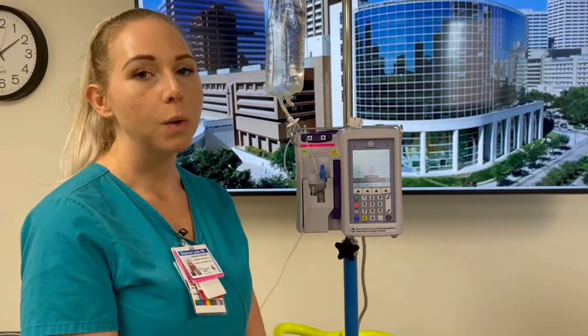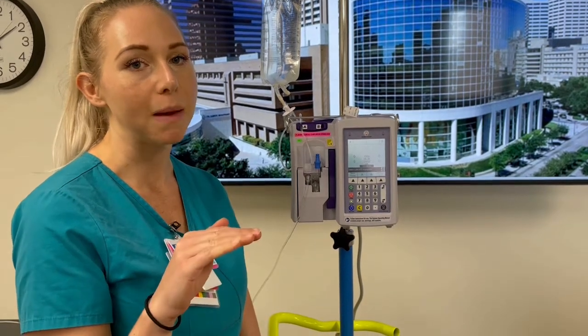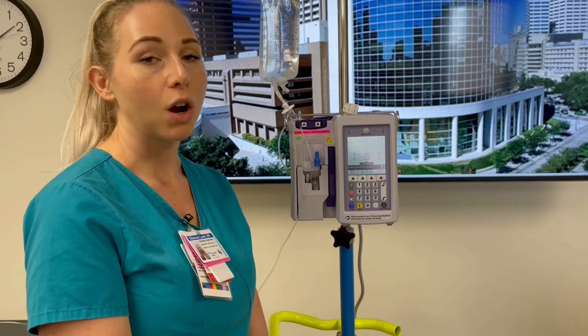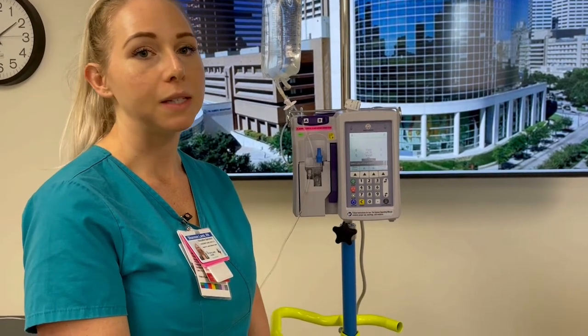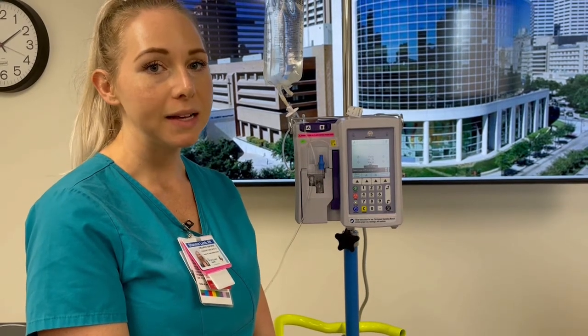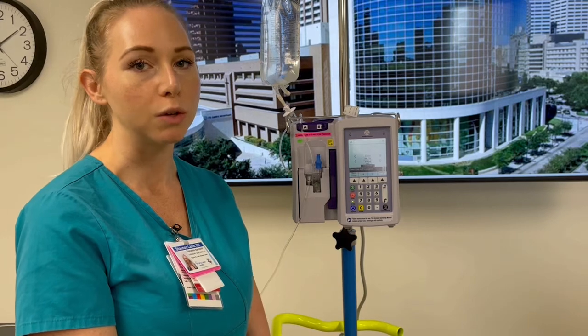This is very important for all of our infusions that are vasoactive medications in particular, or sedatives, because we want the patient to continue to receive that steady dose of medication to avoid having any dips in their cardiac output or dips in their sedation status. So this is a very important safety mechanism that we need to have in place prior to moving forward and programming our infusion.